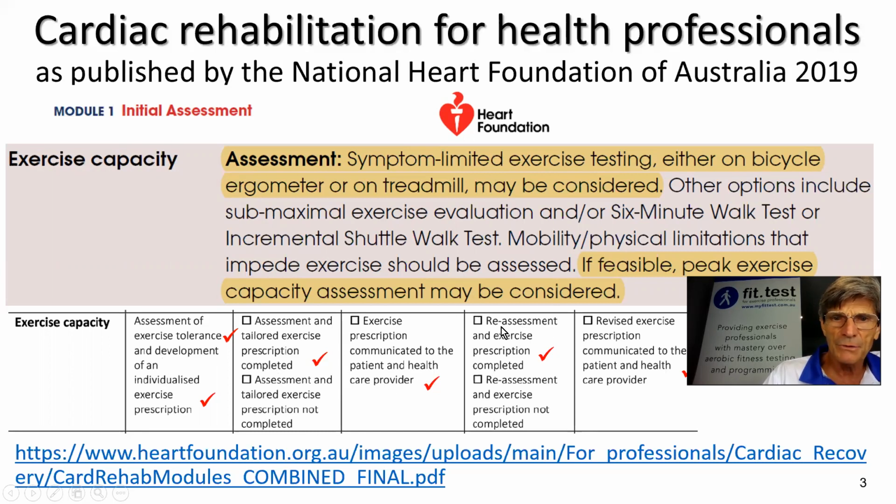We can then use fittest beautifully to reassess our client either during a program or at the completion of the program. Fittest is ideal for doing that, and it does that really simply. And then we can prescribe a further exercise plan and communicate that to both the client and the primary healthcare practitioner. I've given you the guideline reference at the bottom. You can download these updated guidelines from the National Heart Foundation of Australia.